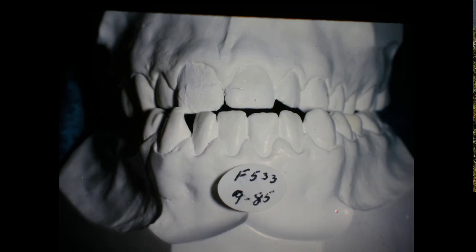Here's the model showing it's got a kind of a crossbite on one side, and the Class 3 is worse on one side than it is on the other. You see where your midline is lined up like that, and this side is further around, and then this is kind of in a crossbite here. I think it's a crossbite on the other side also.